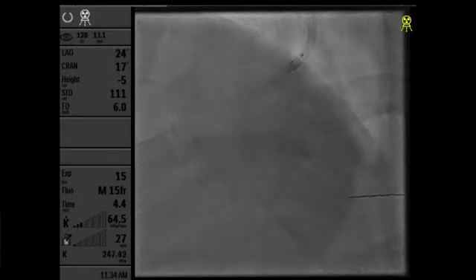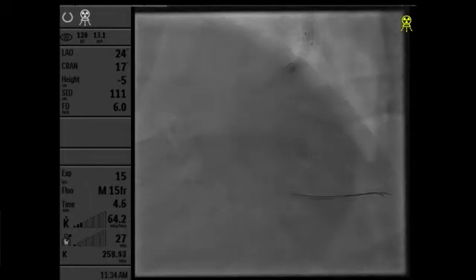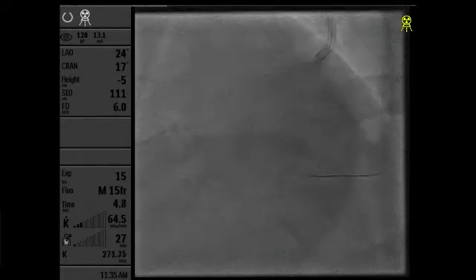We'd like to try another run through wire. You might need to just take a GuideLiner, maybe it will help. Or frankly, intubate the vessel a bit more. It may be more problematic than you would think. And that's part of why starting with the balloon may help. If you guys are looking at the fluoro, its inability to cross the proximal part of the stent, I think the compliance of the artery now is fighting rather than an obstructive lesion.